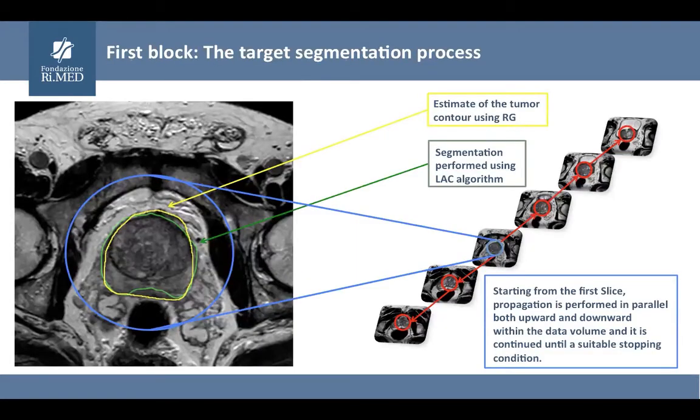In the first step, we used the pre-segmentation step implemented in previous work and adapted to MRI images. In detail, the region containing the target must be localized by the operator. Initial user input is required to roughly identify the area containing the target to avoid false positives. However, user intervention is minimal and limited to drawing a rough contour around the target. No further intervention is needed. A rough inclusion of the anomalous area is sufficient, based on the region highlighted by the user.